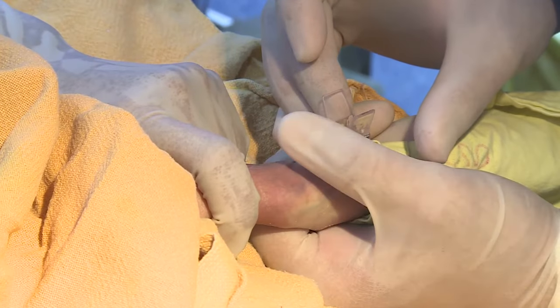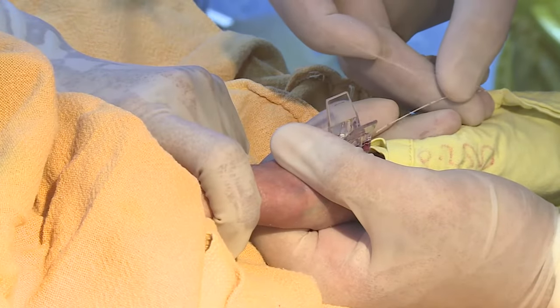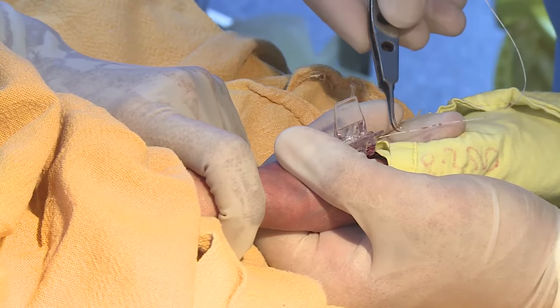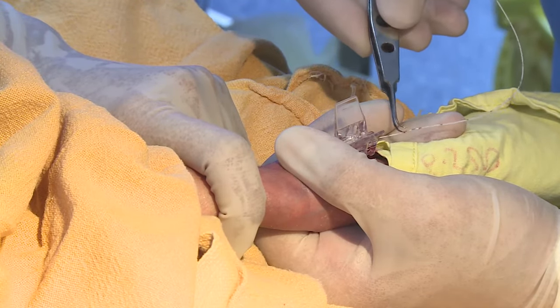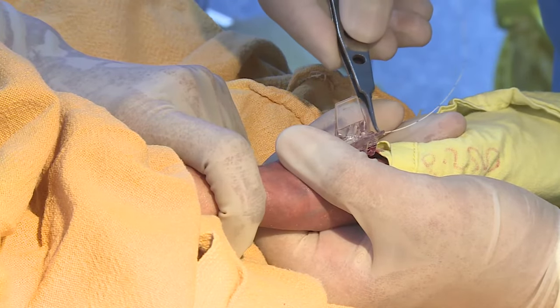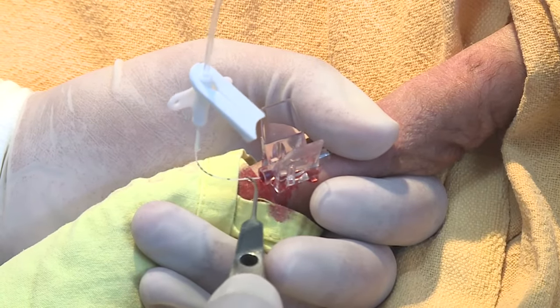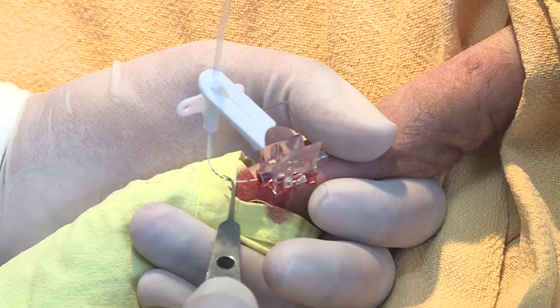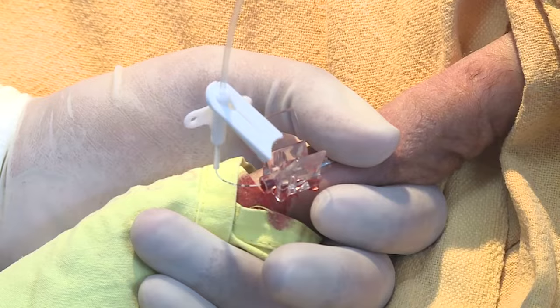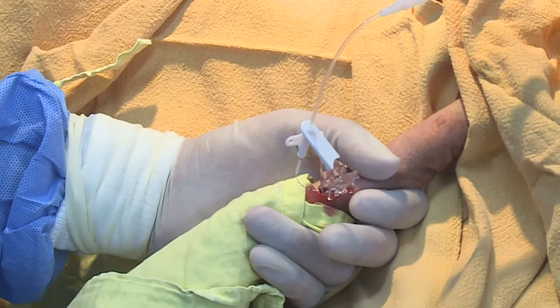As soon as there is a free flow of blood, stabilize the needle. Then through this needle, negotiate the catheter using iris forceps up to the desired length. If the line appears stuck, try maintaining gentle pressure.